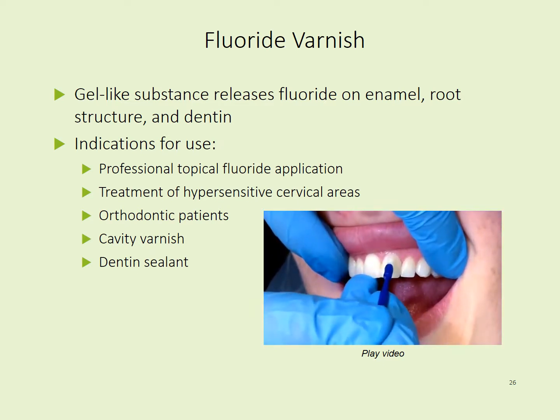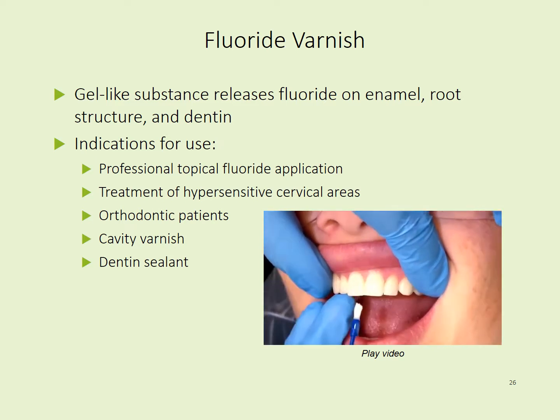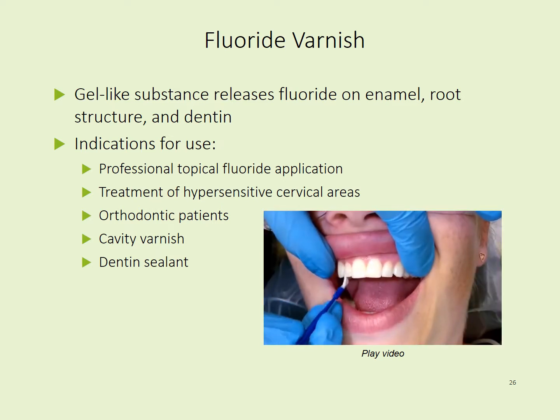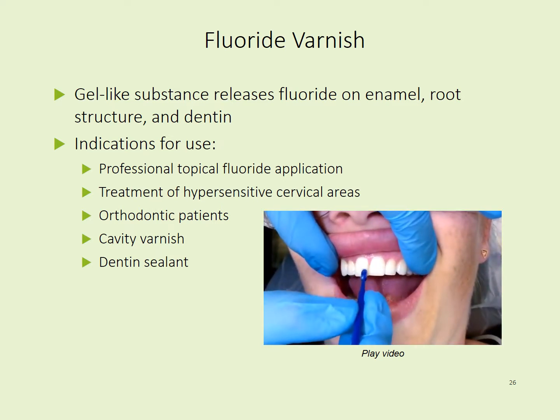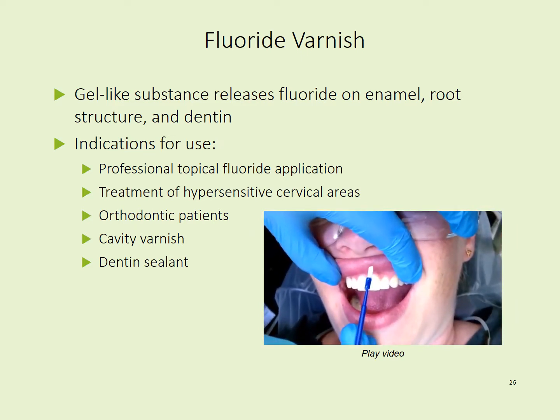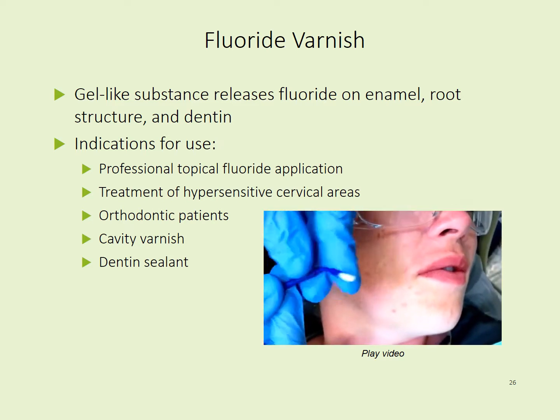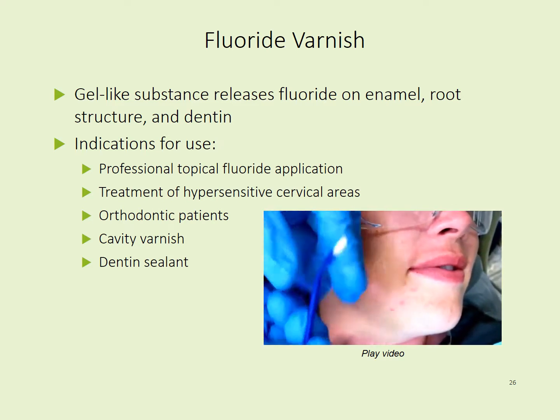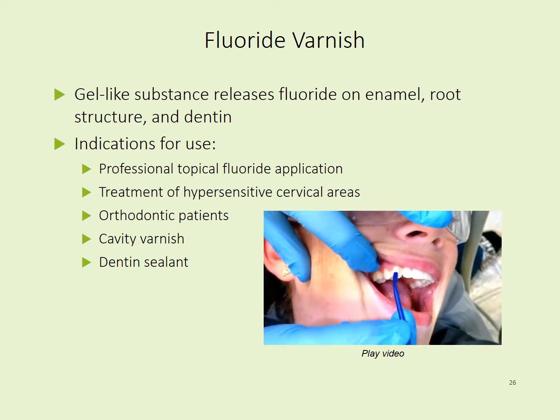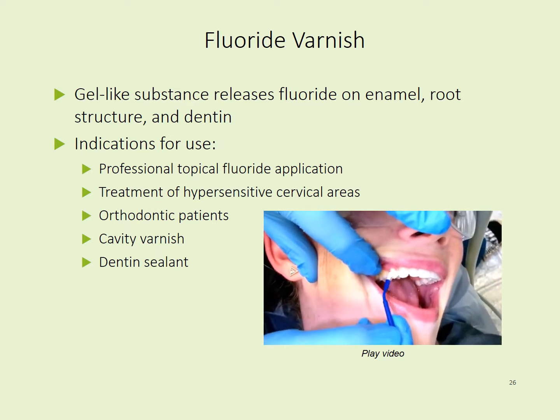Apply a small amount of varnish on your brush and then start near the margin and brush down in 3 strokes. If your patient has a lot of recession or sensitivity, you can also do a little rainbow stripe across the margin like so. Make sure as well that you have a fulcrum so that you have stability to avoid getting the varnish on the patient's lip because the patients don't like the sticky feeling. Also, if you bend the end of the brush at the neck, it will make applying the varnish on the posterior teeth much easier. When billing this code, you want to use D1206, which is topical application of fluoride varnish.